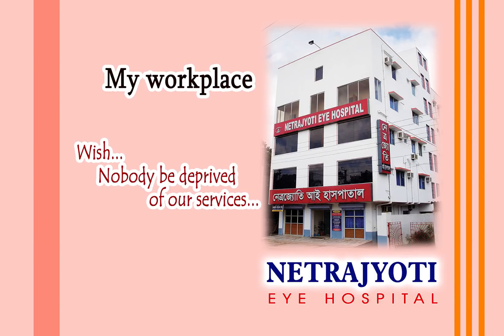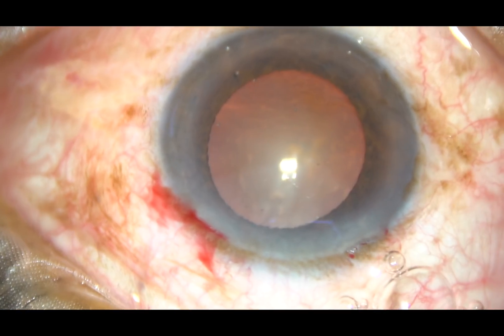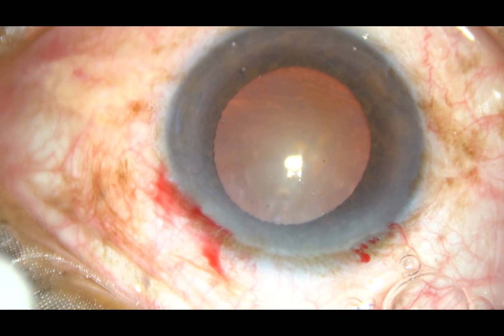Friends, welcome to my hospital at Ranaghat, India. In this video, I want to share my approach of managing a cataract with moderate IFIS, and this is the case.